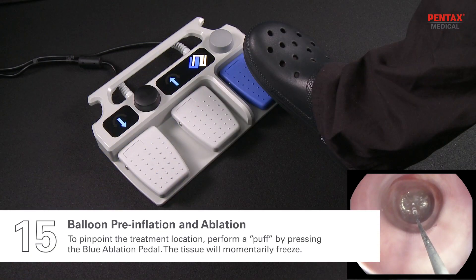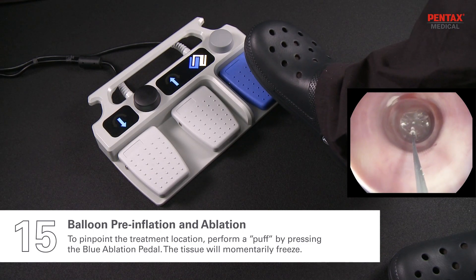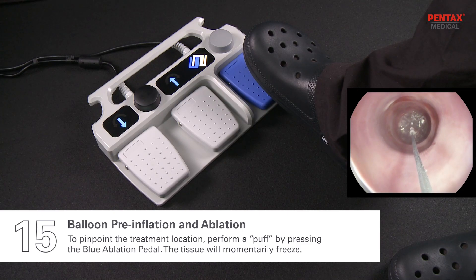To pinpoint the treatment location, perform a puff by pressing the blue ablation pedal. The tissue will momentarily freeze.